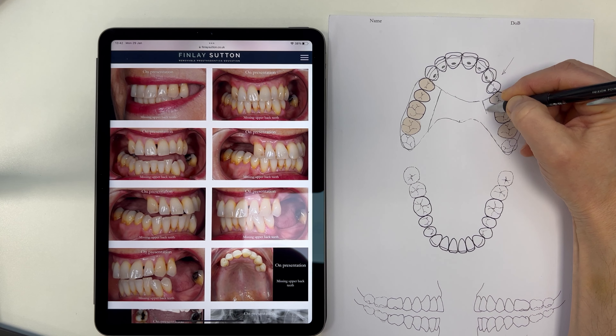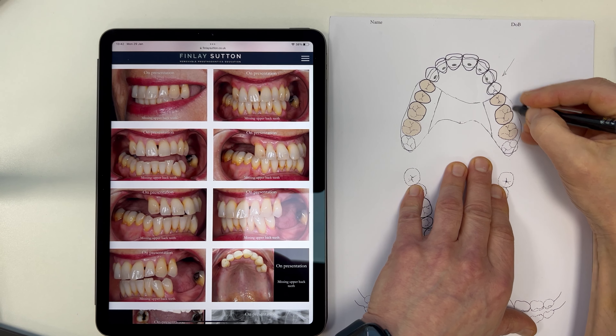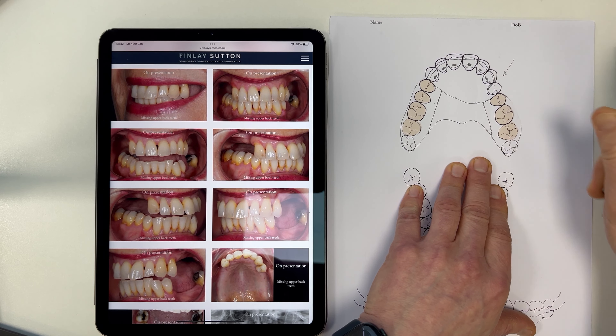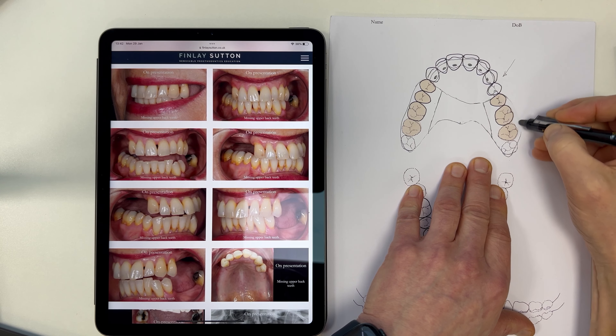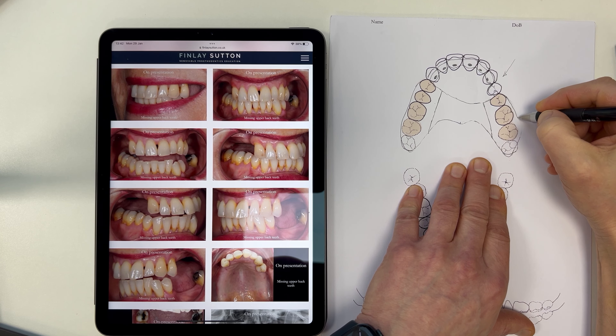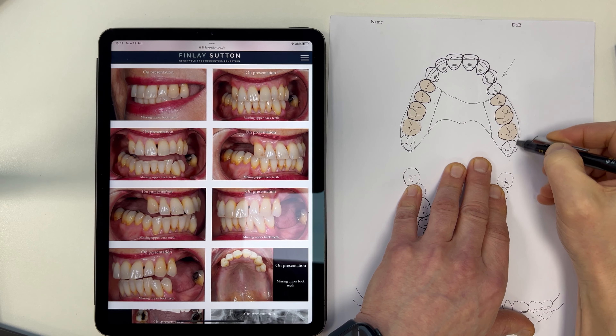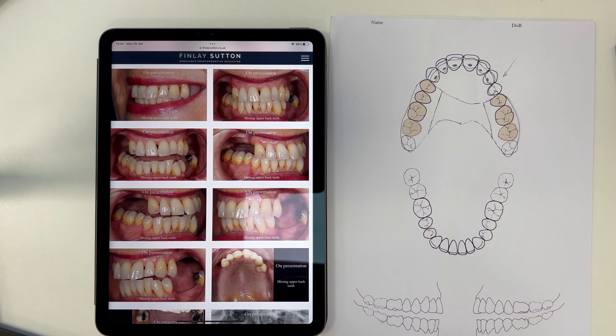This will be a metal framework just there like that, and then we've got the acrylic work just there. That looks a little bit too wide, I don't like the look of it, so I'm just going to rub that out and bring it just a little bit further in like that. That's really good.